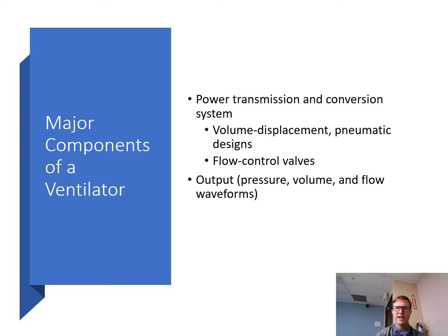So a drive mechanism is the mechanical device that produces the actual gas flow to the patient. So an example of a drive mechanism, you're like, Derek, I don't know what you're saying, right? I hear the words, I don't know what you're saying. So an example of a drive mechanism is a piston that's powered by an electrical motor. So you plug in the electrical motor and then it tells this piston, okay, move back and forth, move back and forth, move back and forth, right? So that is an example of a drive mechanism, right? It's a piston powered by an electrical motor.